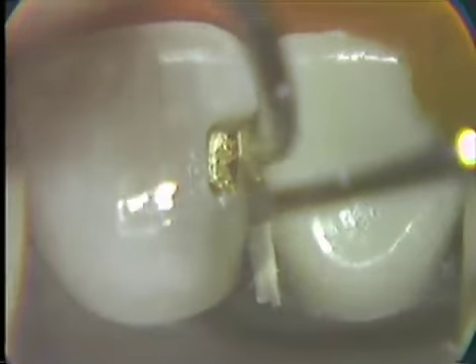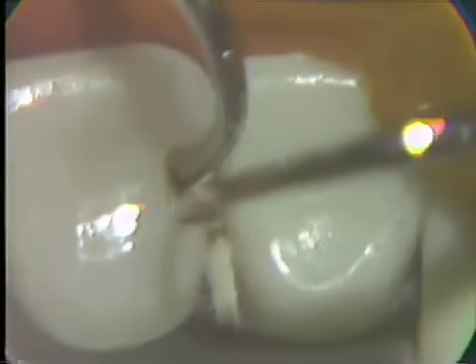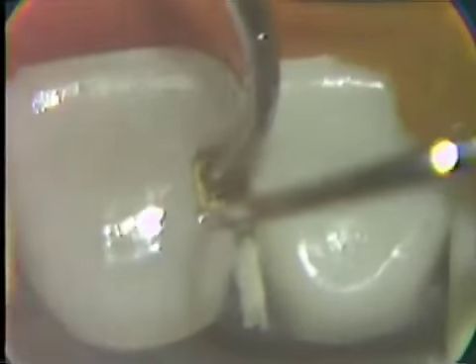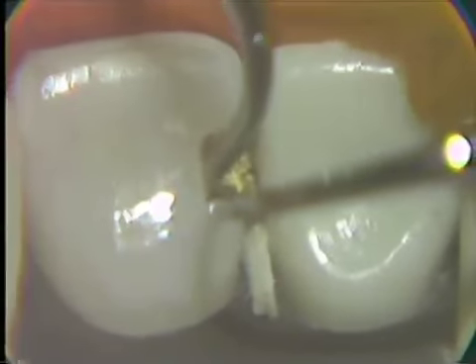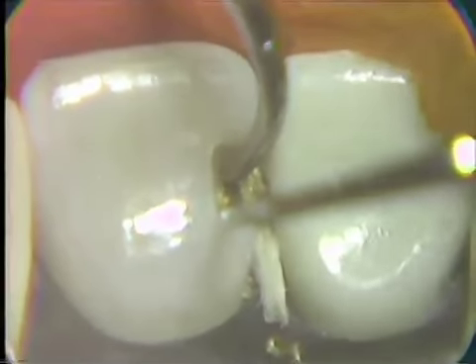Again, with the holding instrument appropriately placed, extend on from that area across into the labial cervical. Stepping the condenser, making sure that condensation occurs in this stepwise direction. And now we ought to be locked into this area, again, from lingual to labial area.